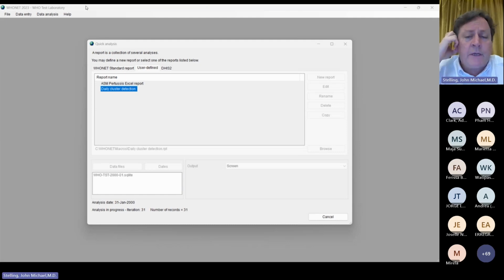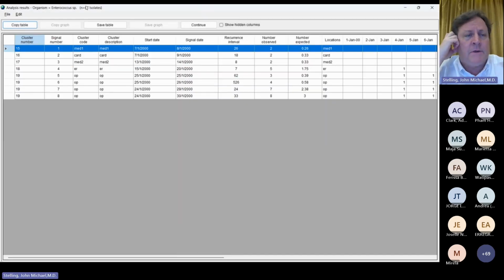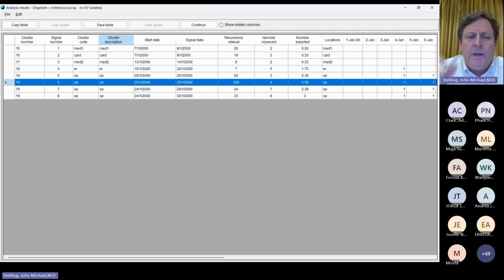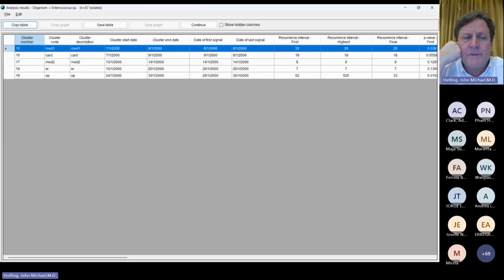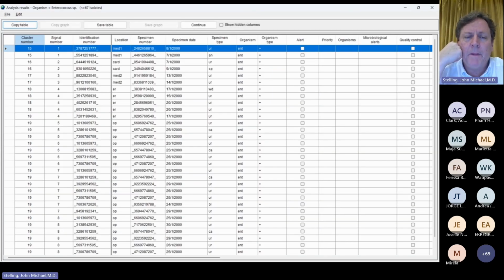And it looked for Enterococcus, but it didn't find, oh, no, it is here. So here's the Enterococcus. And again, everything was a cluster by an individual unit. There's no brackets here, so it did not incorporate the meta stuff. The details, the summary for Enterococcus, and the listing.